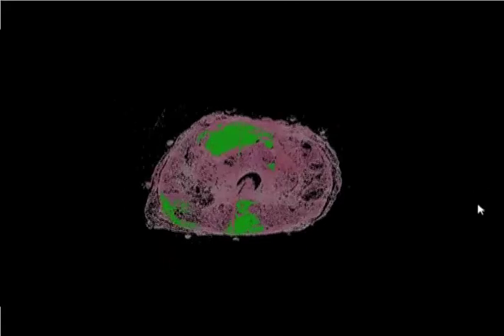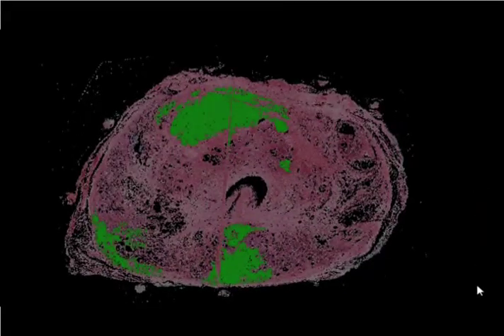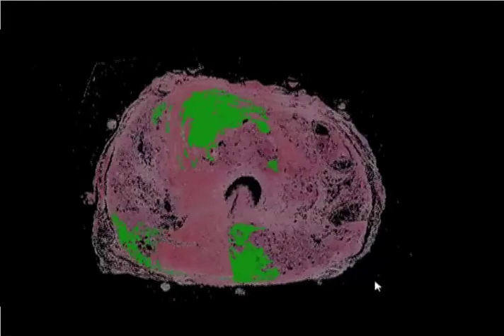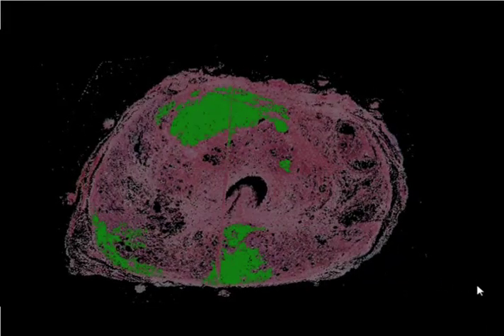So I'll zoom this up here, and to give you a sense of the 3D nature of the disease on our pathology, I'm going to rotate this around, and we're going to look at this mid-gland slice as well as one slice of the apex that's cut perpendicularly so that we can see the 3D shape of this focus. And here you see this focus is extending right into the apex of the prostate, as well as being visible on the mid-gland here.